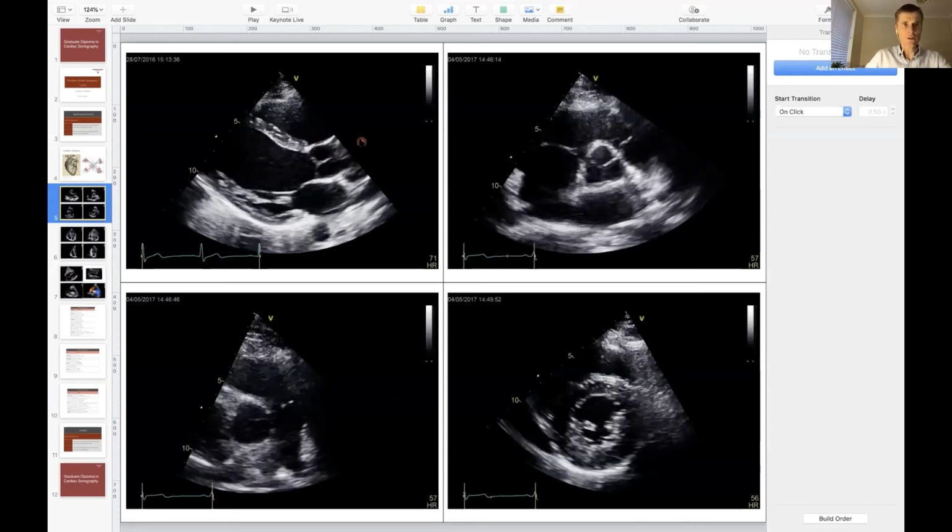Remember, the ascending aorta is broken up into two parts, the sinuses and the tubular portions. And this is the sinotubular junction where those two portions come together. So here are the sinuses. The sinuses are just above these leaflets here as well. We can also see the descending aorta. And interestingly, what we can see in this particular view is, down below the left atrium here, the descending thoracic aorta there. That's important that you recognize that you can see it there.